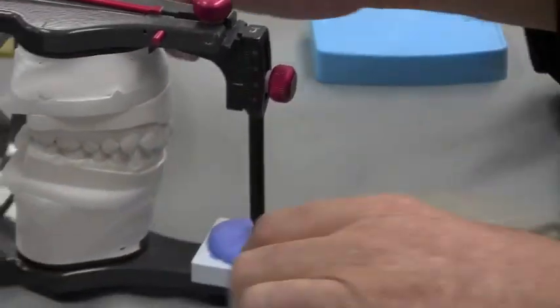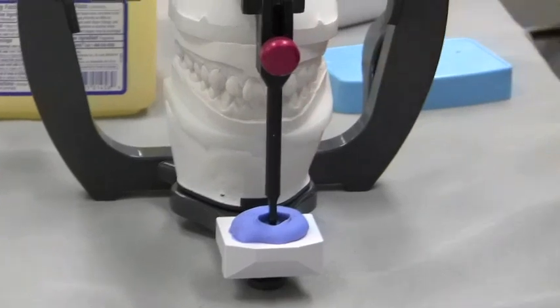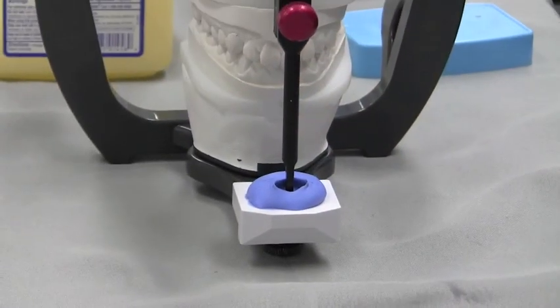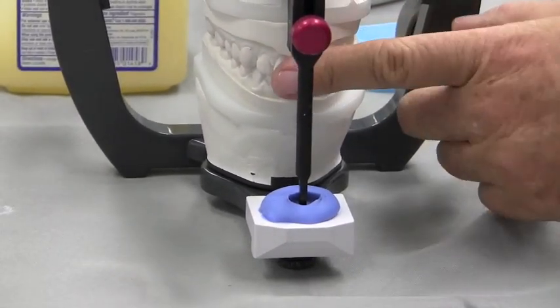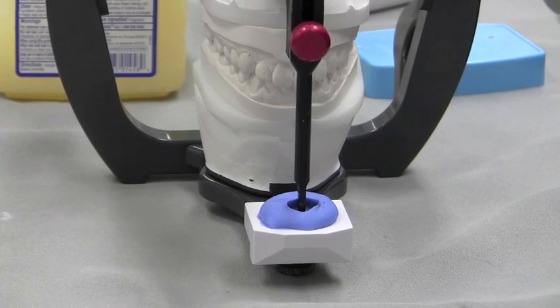We have a really nice smooth anterior guide table that is now a pantograph — a representation of exactly how the lower incisors ride along the linguals of the upper teeth. Now when we remove these teeth, the upper member will still move in exactly the same way it did with the teeth there. And that's how you make a guide table.